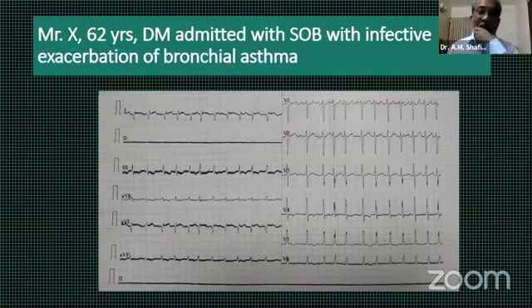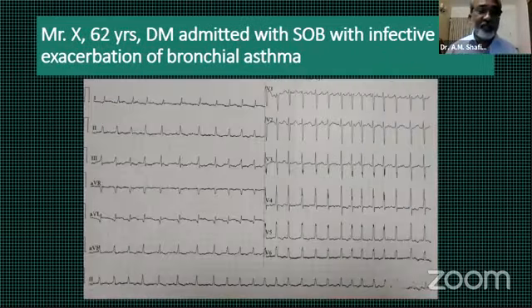Actually, sir, I have seen 3 ECGs, and later on I could get this ECG, and I thought this could be a high lateral MI. That was in my mind, and I went through the patient's previous ECG. There are same changes, and that was existing. And the patient doesn't have any chest pain. Still, I asked to do a troponin test, and later on it was found negative, sir. That was my differential diagnosis.